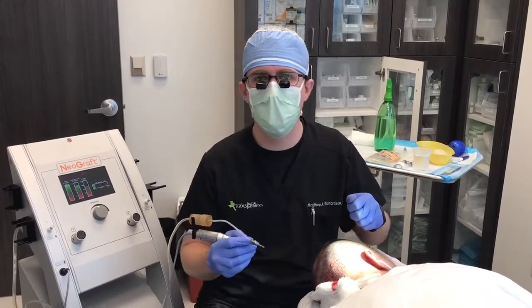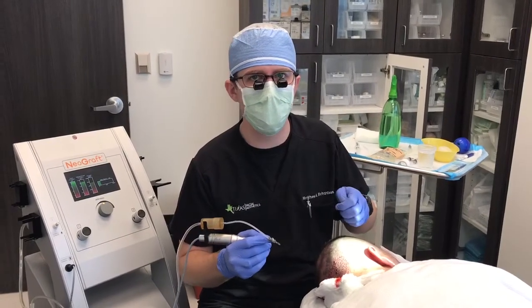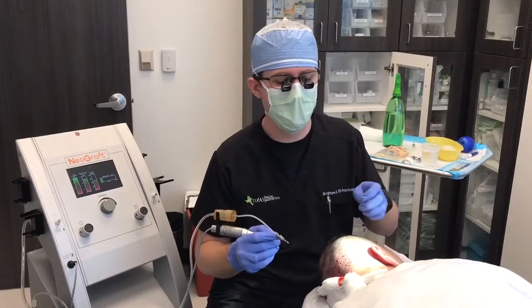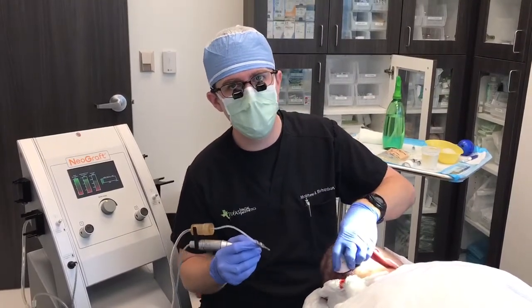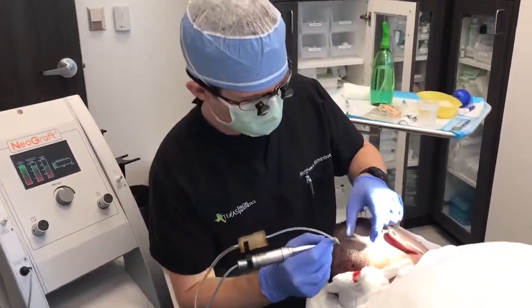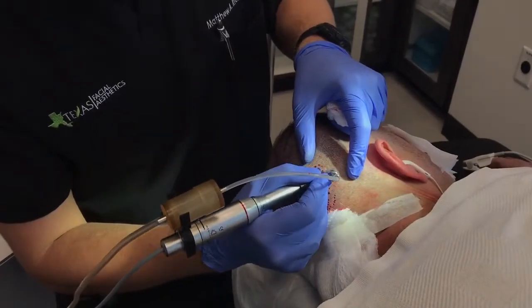The way we're doing it today is with a tool called the NeoGraft. This is a follicular unit extraction procedure where we actually extract the follicles from the back of the scalp individually. So we're harvesting these grafts one at a time. I'll let you zoom in here and take a look at how we harvest these grafts.